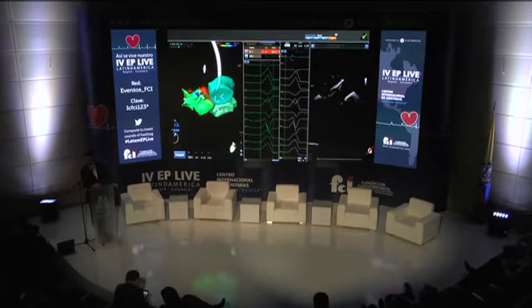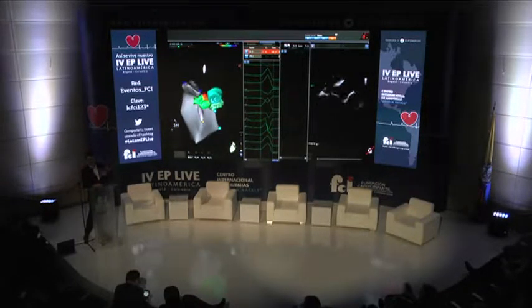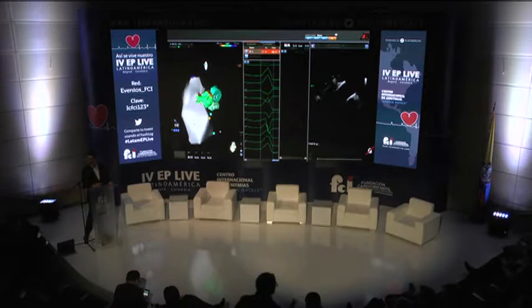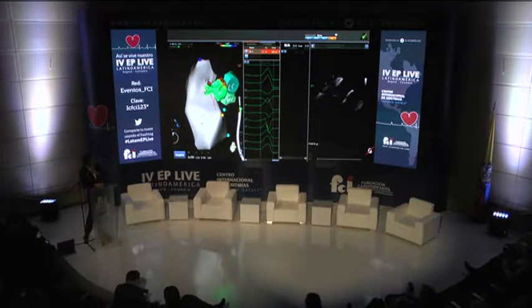That is something that I understand, this is your real world. So what would you recommend for us? What could we do? Well, it's a very good point, Carlos. I would like to transfer that question to Andrea. To be honest, we do everything with ICE, and we haven't done guided procedures. Of course, you can do them, but you have to have very good experience for the location, for determining in which cusp you are. Andrea.